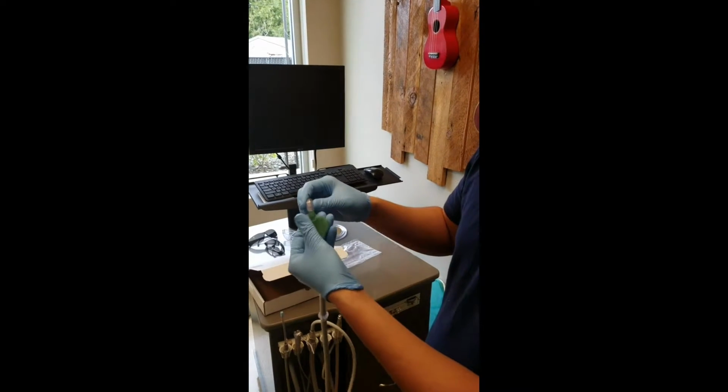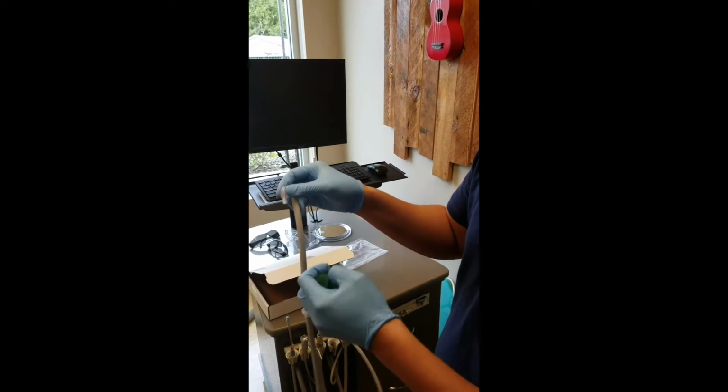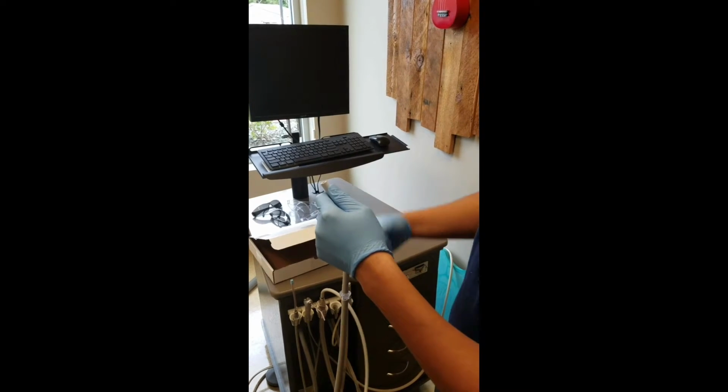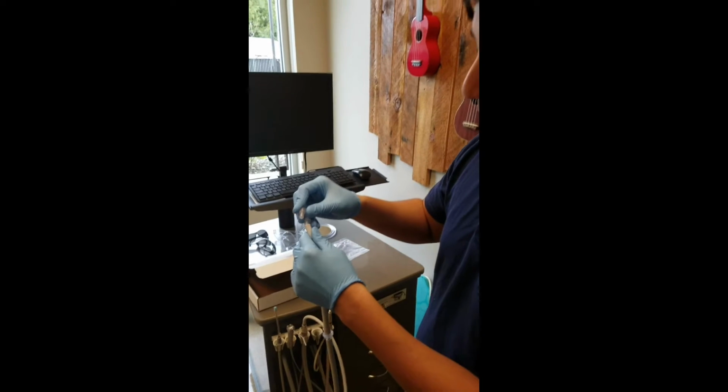When you're done with the patient, you just dispose of the leaf, take one of these U-bends off, put this in the autoclave, wipe this down, and then grab another U-bend and place it right back on.